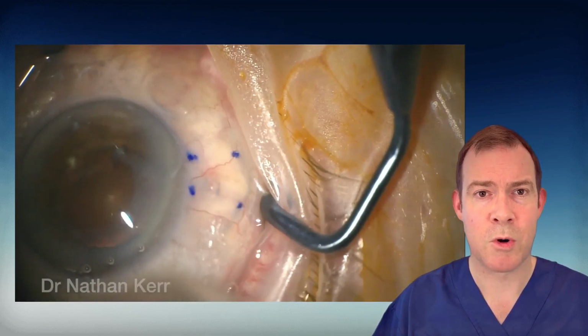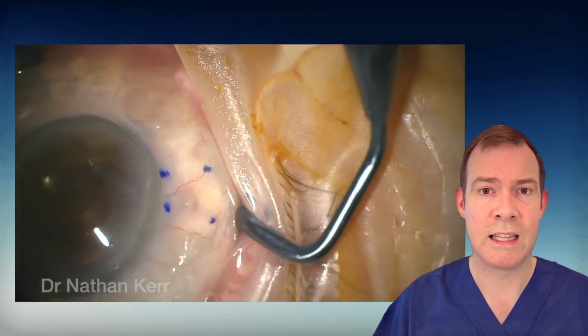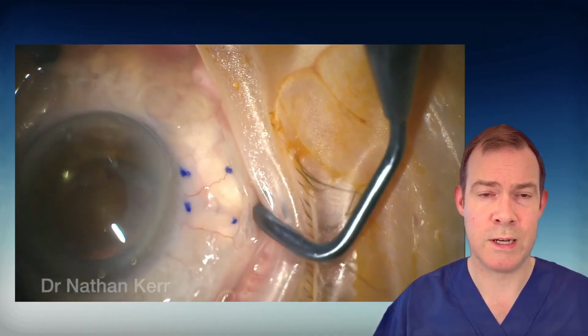Here's another example of primary needling. We can see the air and the viscoelastic in that space. We're passing the needle above and below, really ensuring that it's completely free.